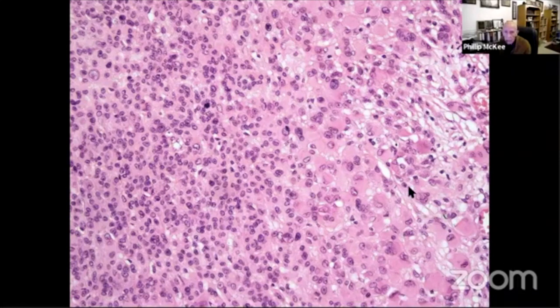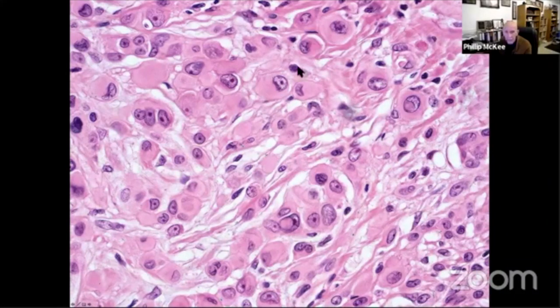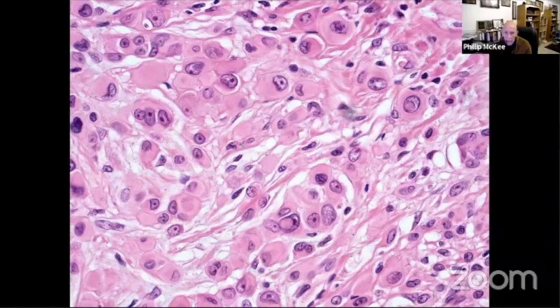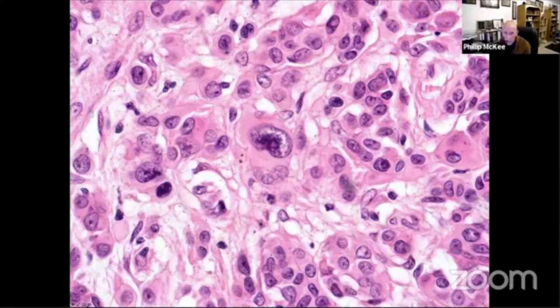There you can see some high power views — very prominent nuclei and there are some cytoplasmic pseudo inclusions, which are thought to be more commonly seen in the inherited form of BAP1 inactivated nevi, although I have no knowledge of whether there was a family history about this particular patient. There was quite marked nuclear pleomorphism — there's a huge nucleus there, which gives you an idea as to why I thought this was melanoma. And there's an atypical mitosis. I don't have any follow-up unfortunately on that patient, but I think that must be the first BAPoma that I ever saw — and I misdiagnosed it.